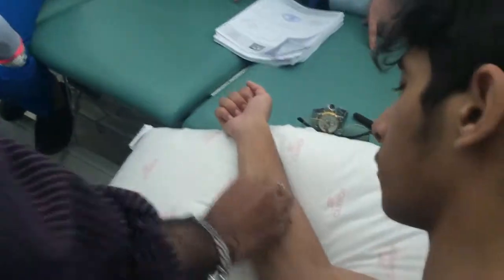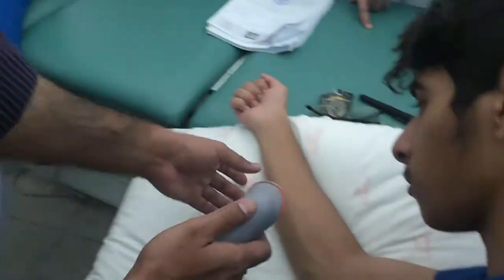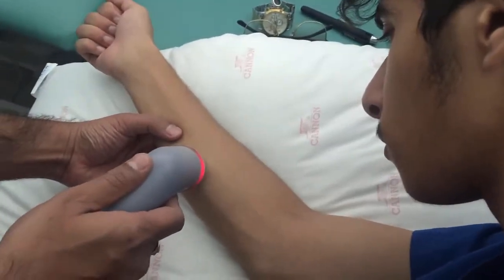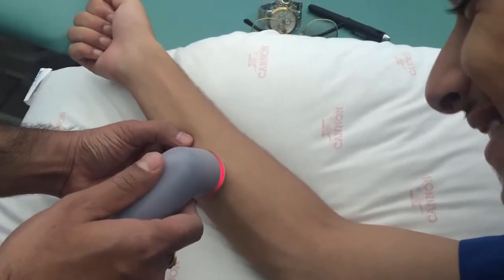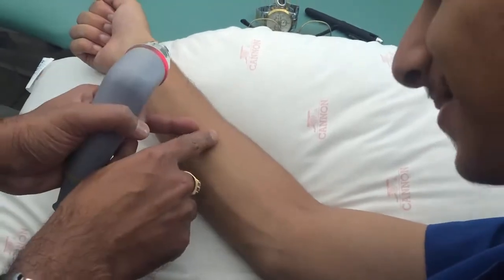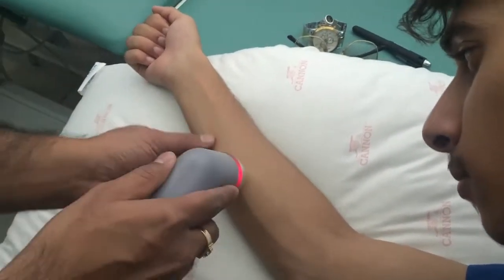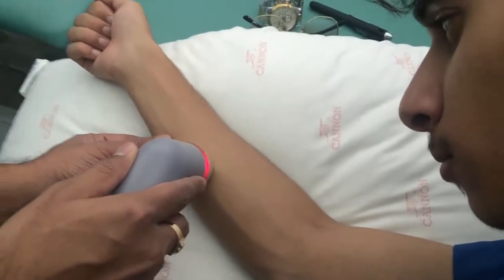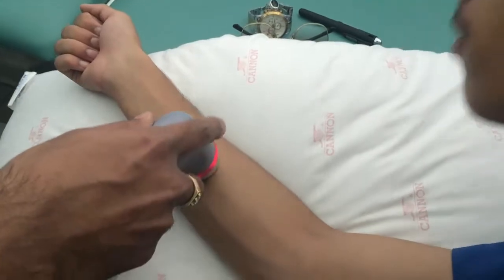In case the patient is having pain here, I can use the grid technique. Grid means we can touch. Nothing will happen. Understood what I am talking? So I am making this painful area into box grids. I am just putting here for a few seconds. It should be perpendicular.